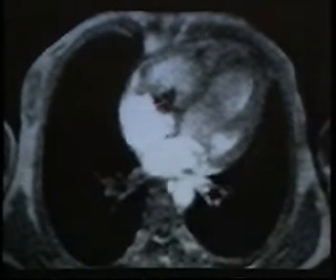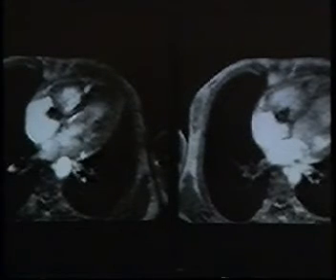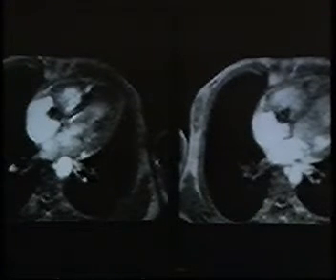I can't tell you that this is not a myxoma, but here you have to have some kind of clinical information about the patient. This was a drug addict. 8 weeks before this time, at an examination, had a normal echocardiogram. This time has a mass on the tricuspid valve and had a fever. This is bacterial endocarditis with a vegetation, and the patient was treated with antibiotics, and after a suitable period of time, this lesion disappeared. But I cannot distinguish this from a myxoma unless I have this clinical history.